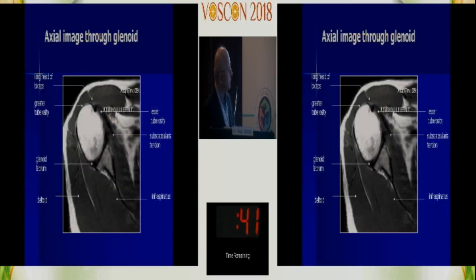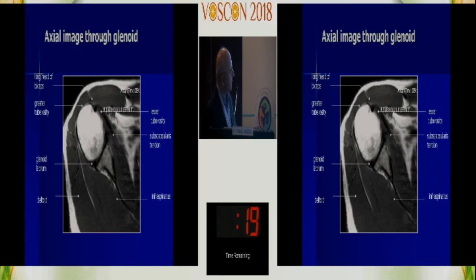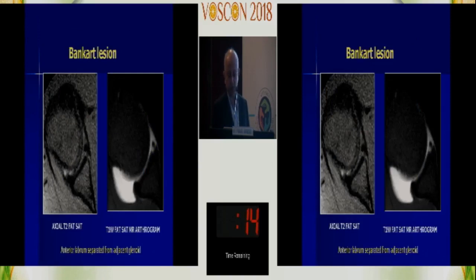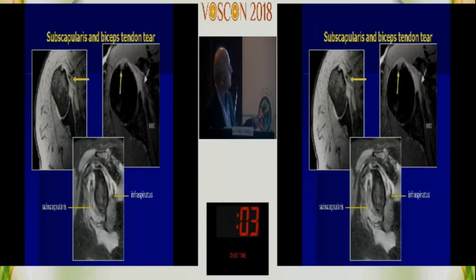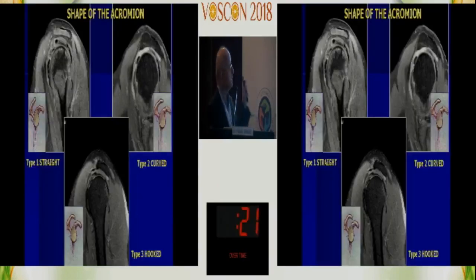Now looking at the axials — again front to back, out to in. You see the anterior deltoid, the biceps in the groove, the subscapularis coming and attaching, the MGHL below the coracoid, the head, anterior and posterior labrum, and glenoid. Spare a thought for the suprascapular nerves and look for spinoglenoid cysts. At the back: the infraspinatus, the capsule, and the posterior deltoid. For an instability patient, you can see labral detachment on STIR sequences, which is even clearer on arthrograms. In one case: subscapularis detached, fluid everywhere, labrum looks reasonable, biceps tendon missing from the bicipital groove, and the infraspinatus visible.